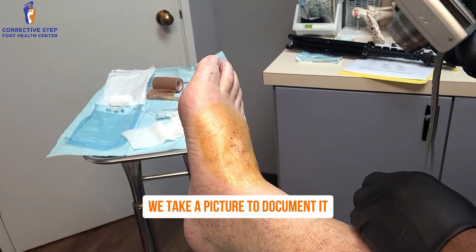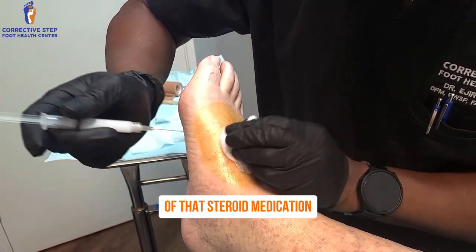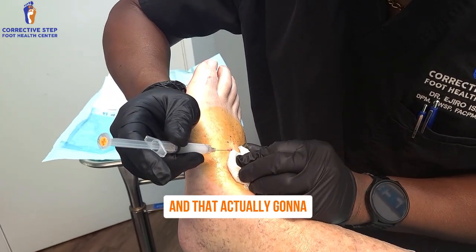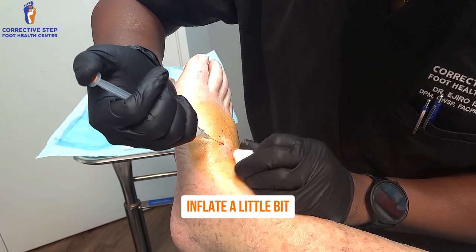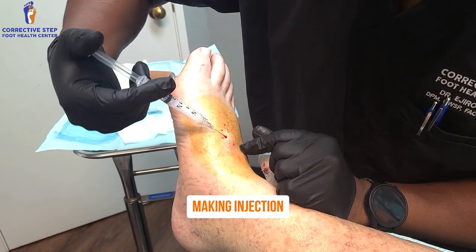We take a picture to document it. Now that we've documented, we're going to give a little bit of that steroid medication right into that cyst cavity. That's actually going to inflate it a little bit, make it look like there's still a cyst in there — but now we know that that's just a steroid injection.